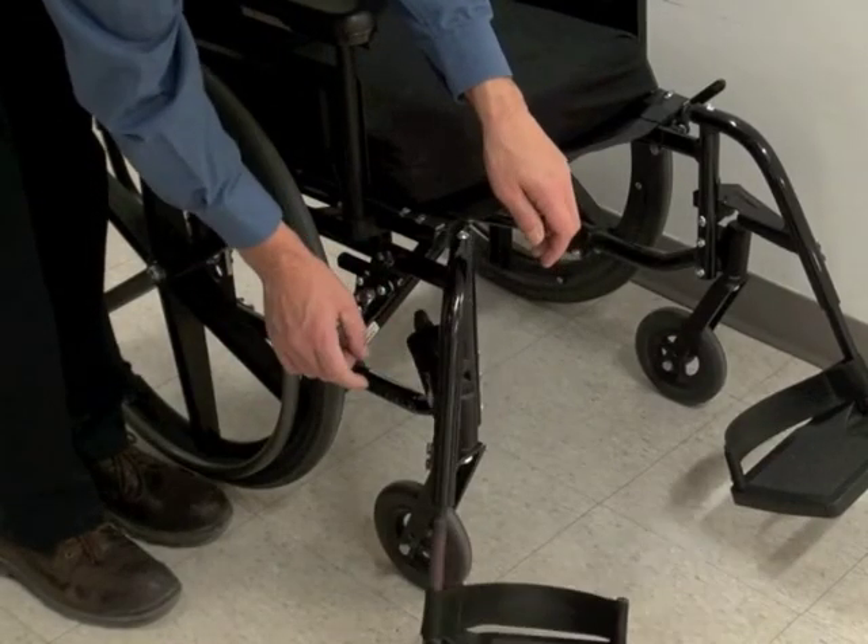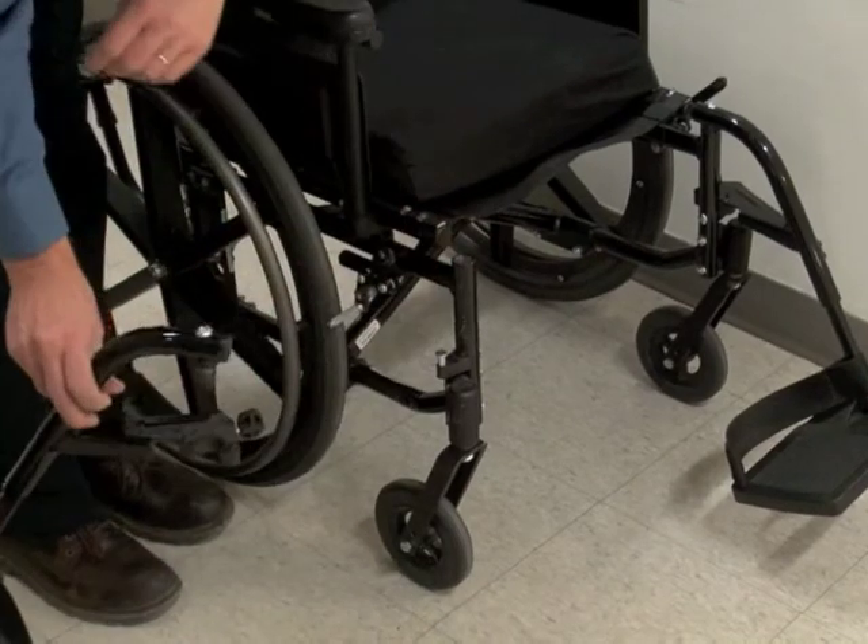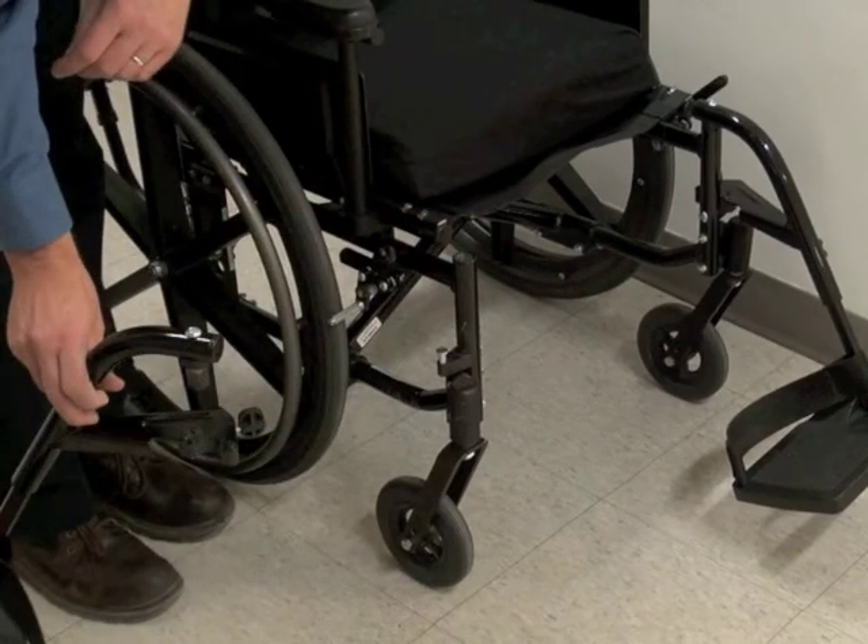Most footrests have a small release mechanism that allows you to swing them to the side and out of your way. Typically, the footrest can also be removed by lifting it out of its housing while in the swung away position.